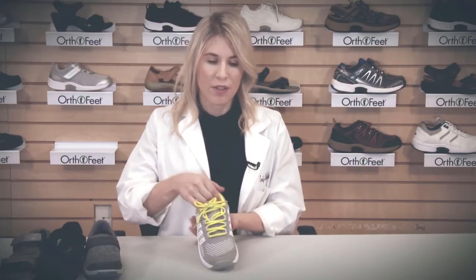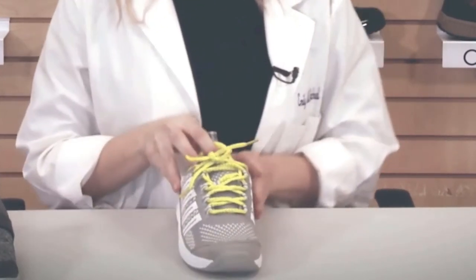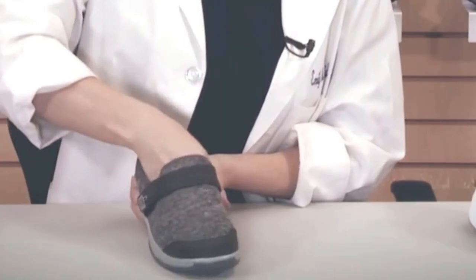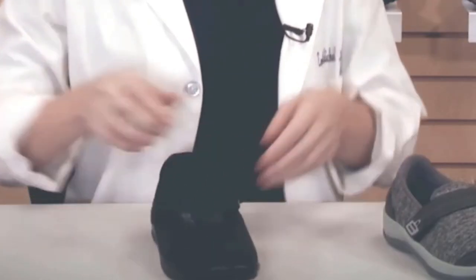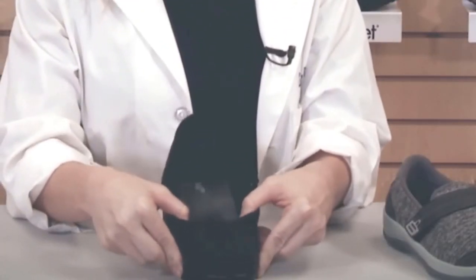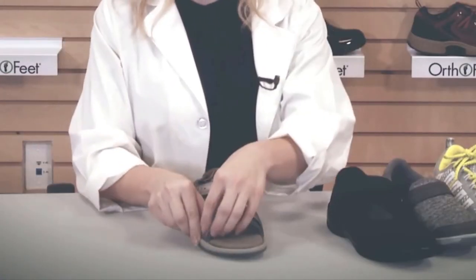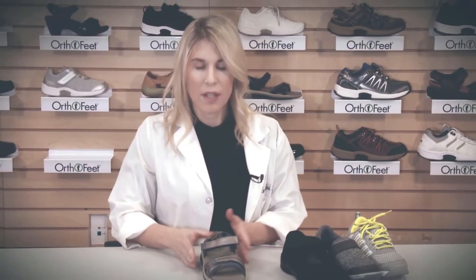Another important feature of all OrthoFeet shoes is the stretchable upper. The stretchable upper contours to the shape of the foot, allowing a loose, comfortable fit. This is available in all OrthoFeet shoes, accommodating for bunions and hammer toes. The looser the fit, the more comfortable the shoe, and you avoid areas of excess pressure, which can cause friction and blisters. This stretchable design is also available in the sandals. A stretchable upper is important for those who may have sensitive feet, diabetic neuropathy, bunions, and hammer toes.